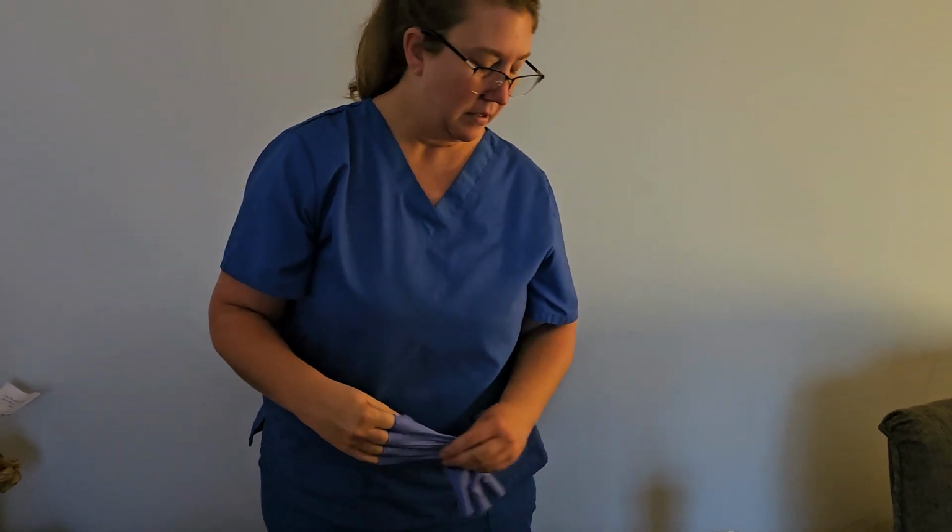Now, I'm going to take off my gloves, perform hand hygiene, and I'm going to tell the patient, do not scratch it, do not rub it, don't mess with it. Because the purpose is we're wanting to see a reaction around that site. And if they do that, that may interfere with the reaction.